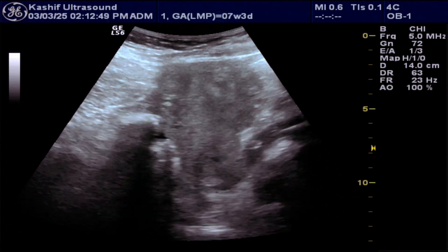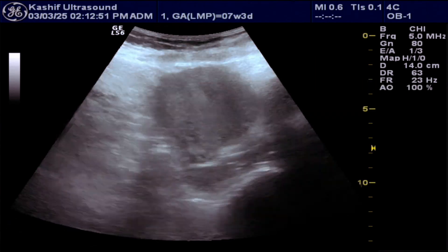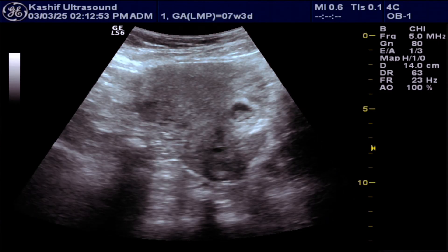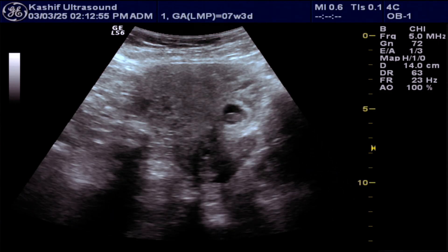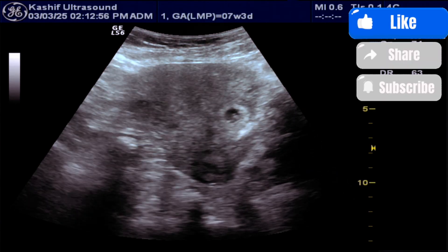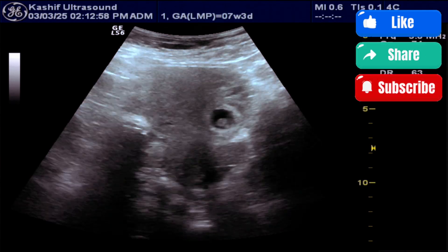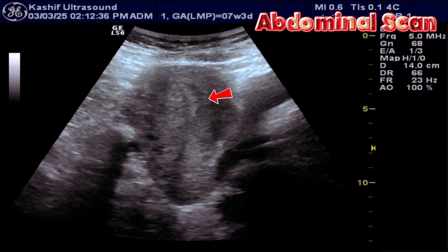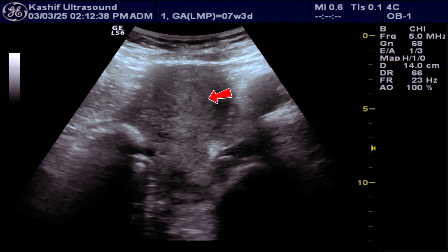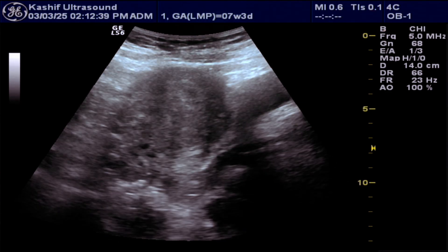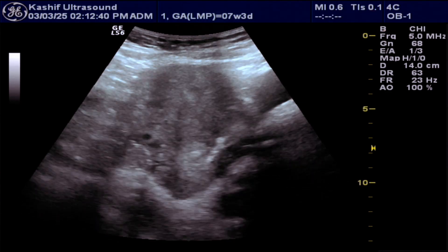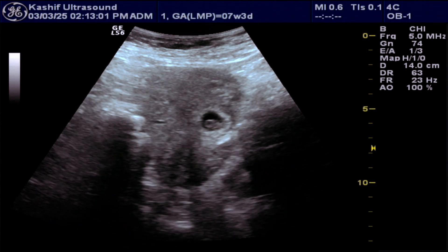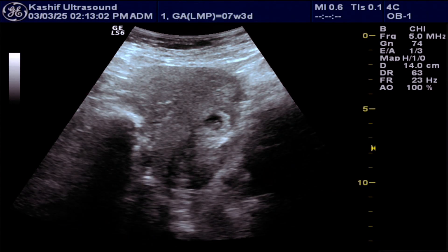This female patient is 7 plus weeks pregnant. She has a history of two previous cesarean sections. This is the abdominal ultrasound scan showing an empty uterine endometrial cavity. A well-defined gestational sac is visible in the lower third uterine segment anteriorly.